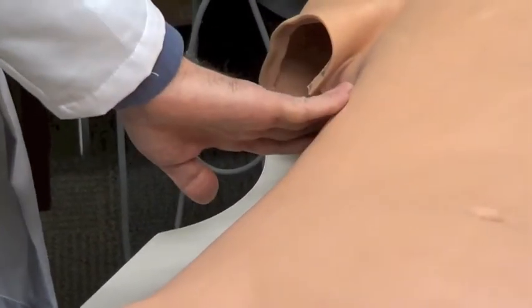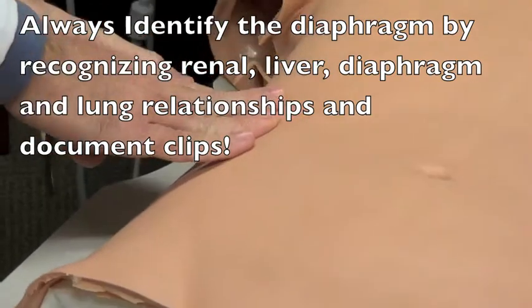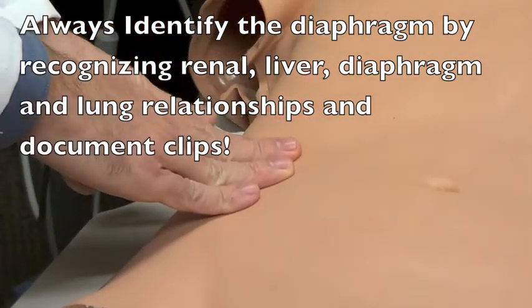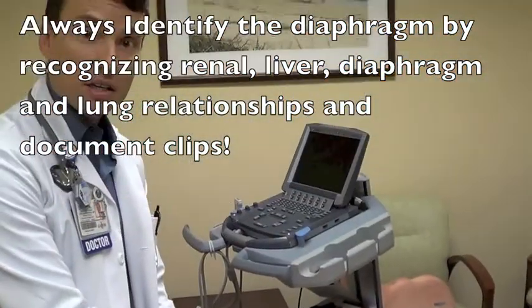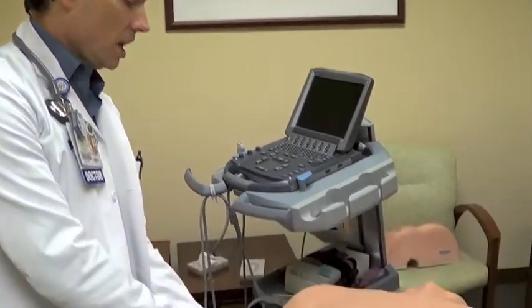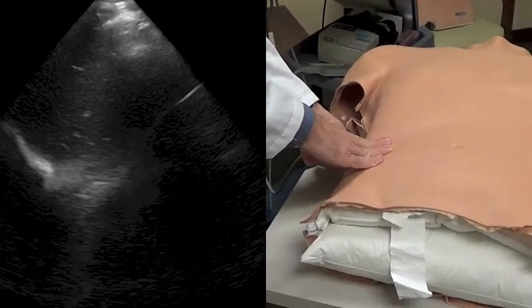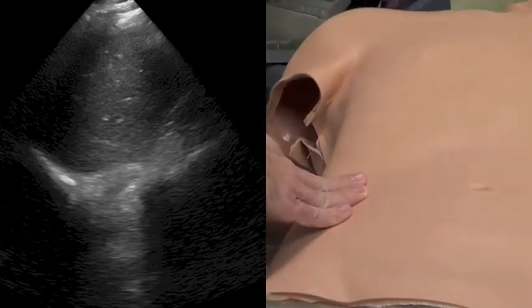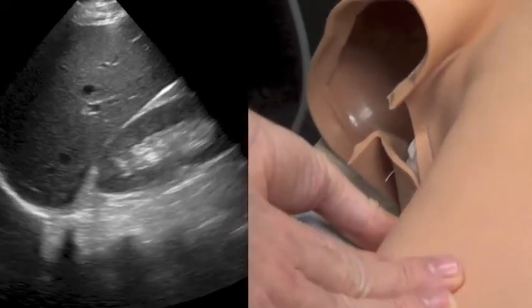In this case, the patient's right-hand side. I'm first going to start a little bit more inferiorly, which is very important in patients with either diaphragmatic paralysis or a history of emphysema, because their lung fields will be enlarged. Basically, I'm going to go a little bit posterior and identify the kidney. Moving cephalad with the probe, I'm then going to identify the diaphragm.